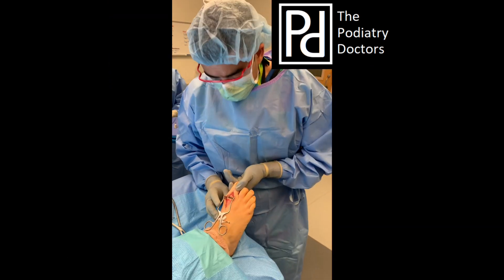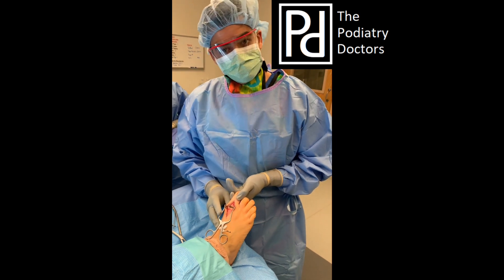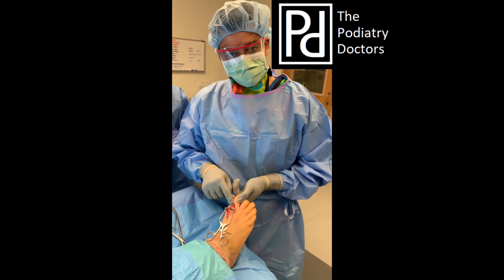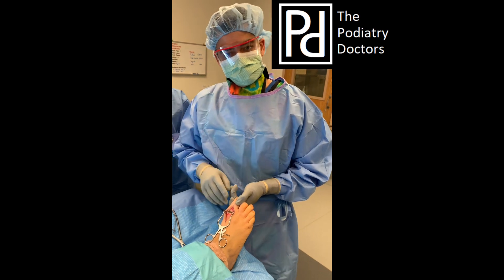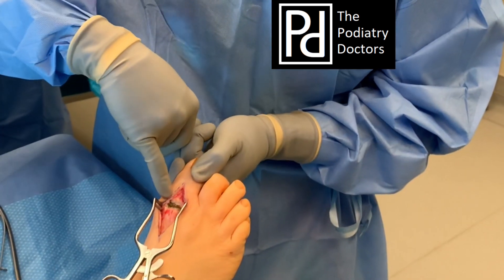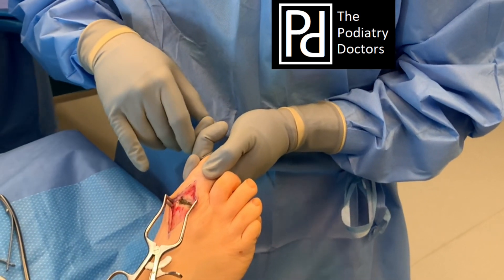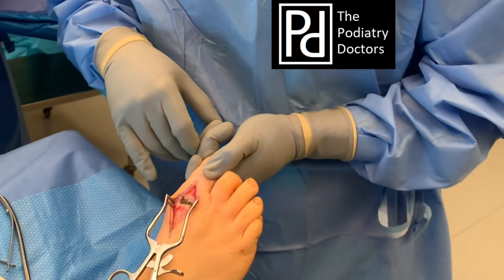So now we've opened up the joint. We have good visualization of both the proximal phalanx and the metatarsal. After we've removed some of the fibrosis that's formed over the last five years or so, you can now see that silicone implant — that darker coloration inside the joint there. We'll be removing that with the grommets before we put in the bone graft.